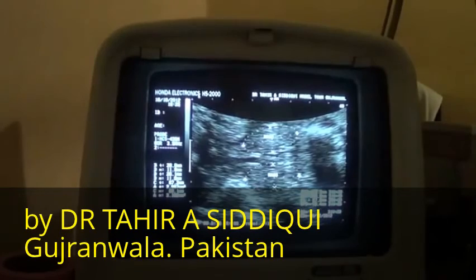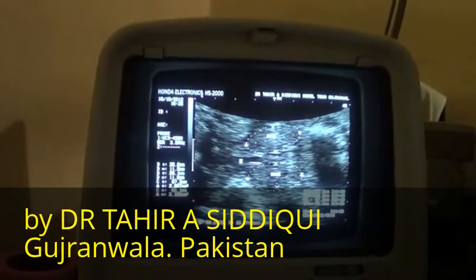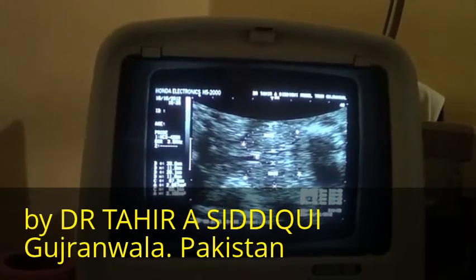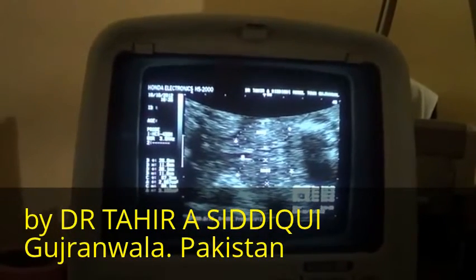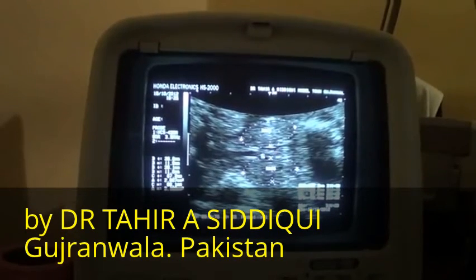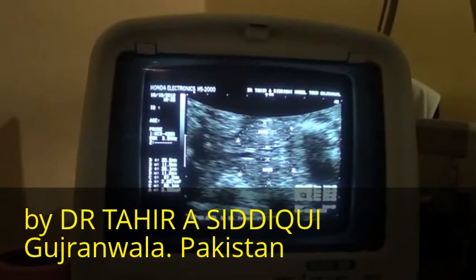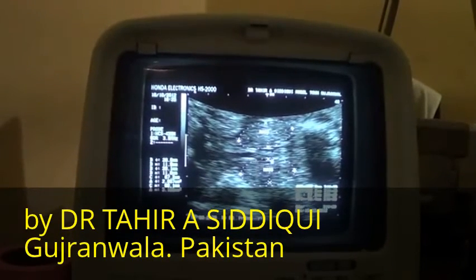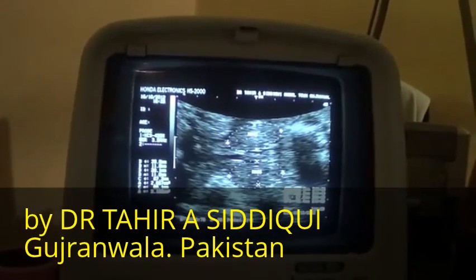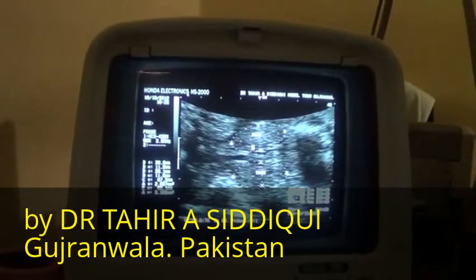And there is a vessel that is traversing through the center. If it had been a trachea, then in that case we should have been seeing air and the air shadow. There is no air shadow seen in this region. So this is a vessel entering the heart. The bilobed, evenly echogenic mass with no calcification or any cystic area within it. And this is a neck mass, region of the neck.